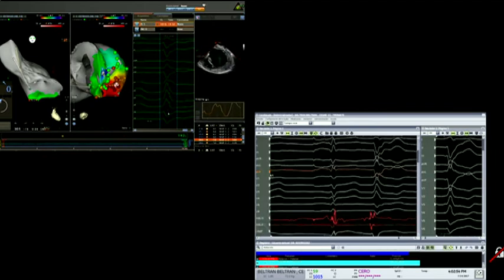That's why we ablated a little bit more towards the other papillary muscle, more on the lateral side of this posterior medial papillary muscle. We haven't had anything after that resembles those. So we are going to give dobutamine to try to induce more PVCs.